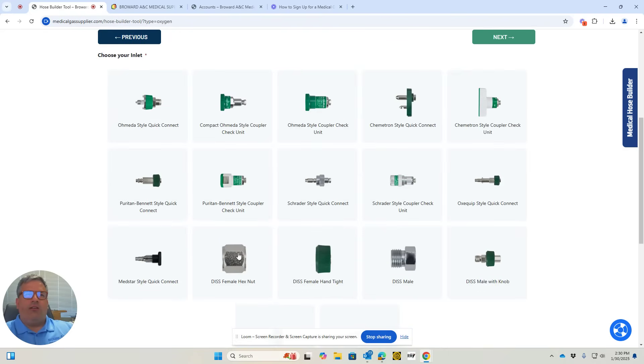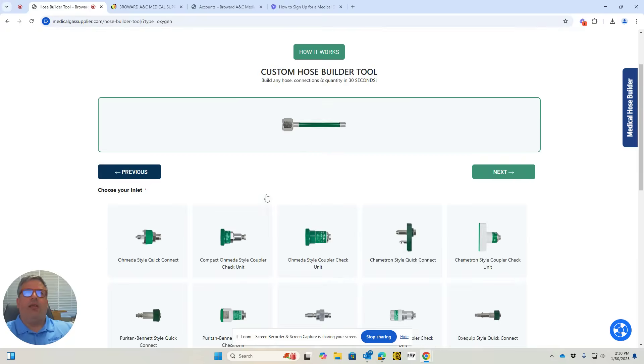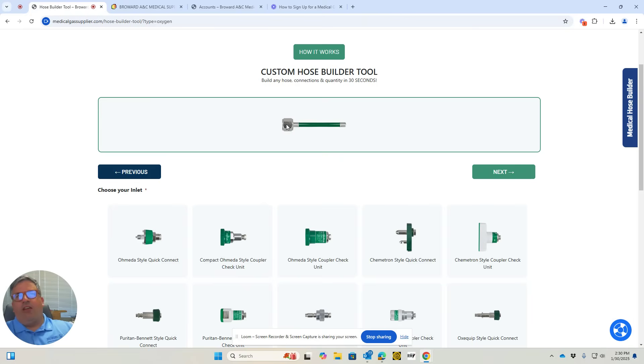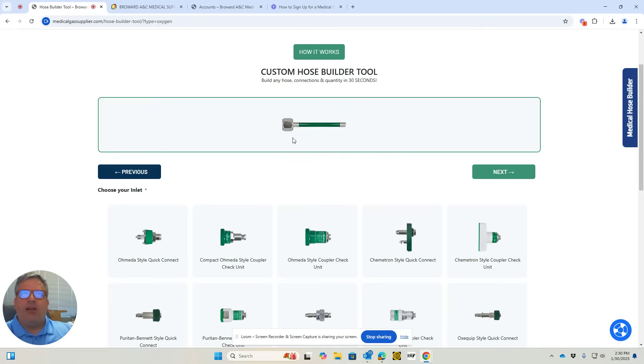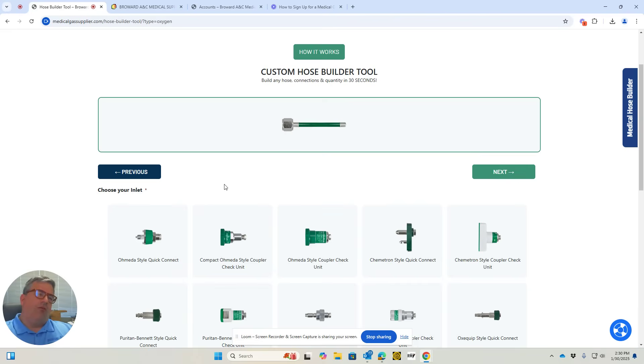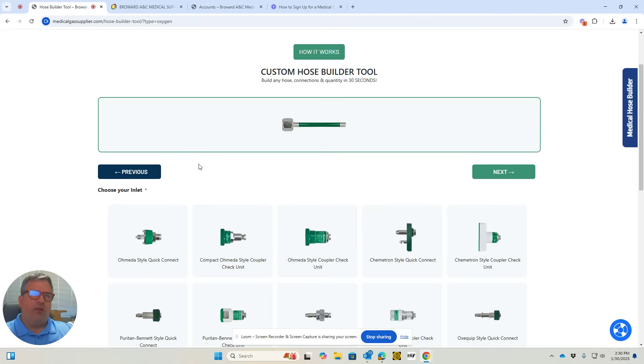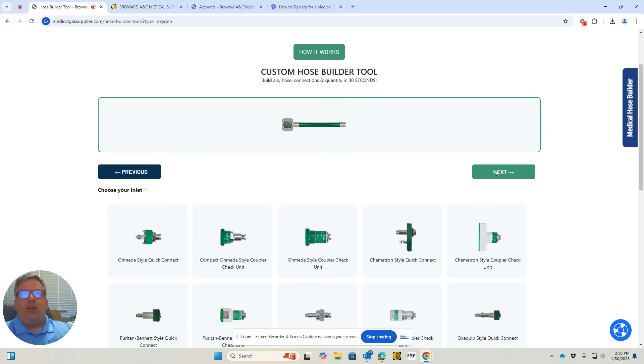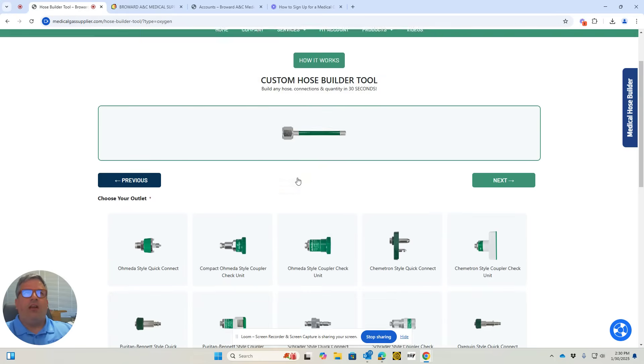One side is going to have a hex nut, and that's standard. It's found on the bottom of all your medical gas regulators. You'll have a DISS male connection there, and that hex nut fitting is gas-specific. The one for oxygen will screw onto an oxygen regulator, the one for air, and so on. So we put a DISS hex nut there. On the right side, you'll hit next to get to the other side.